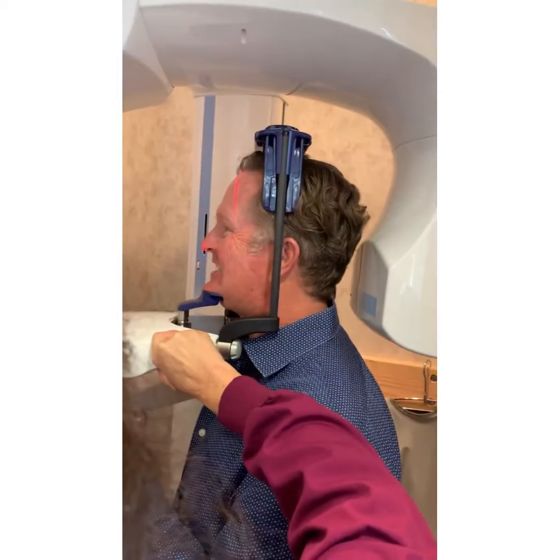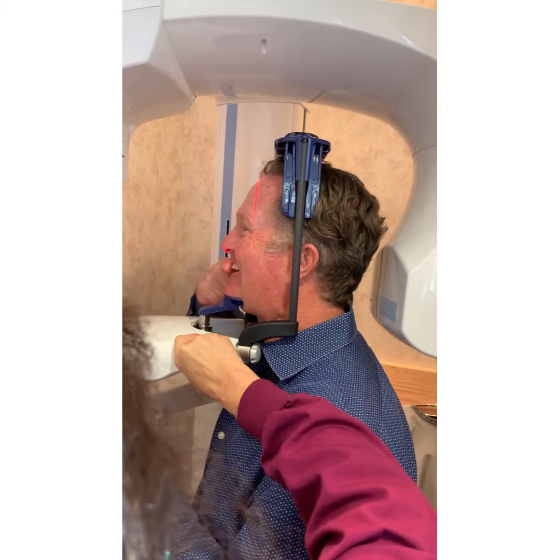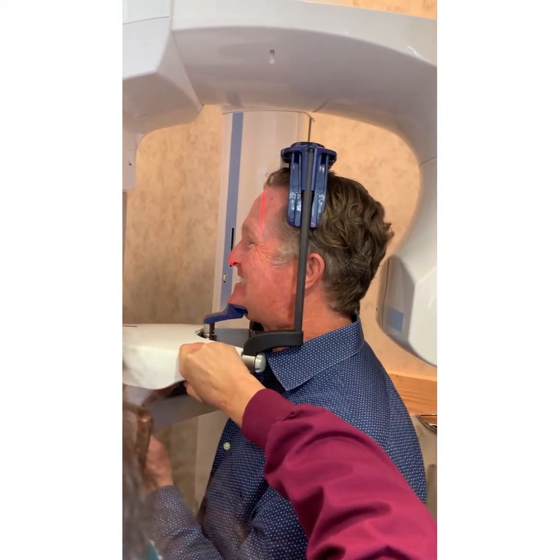You're too far on his nose. Don't worry about it on my face, you're just looking at it in here. Okay, say smile. Smile. Fine. Yeah. I can't tell from this side.